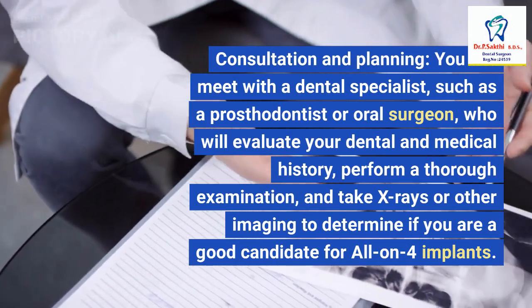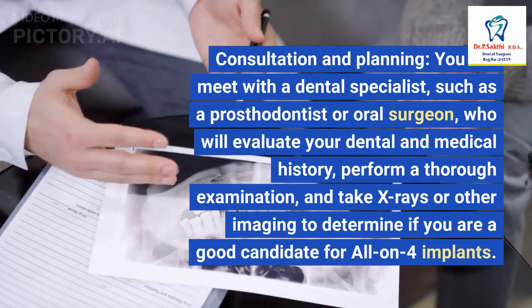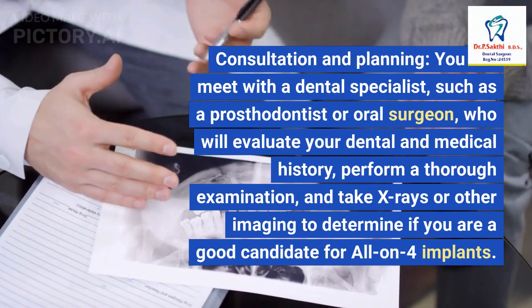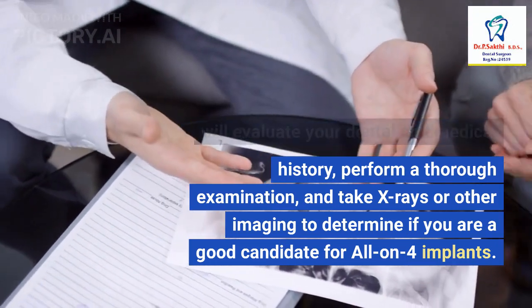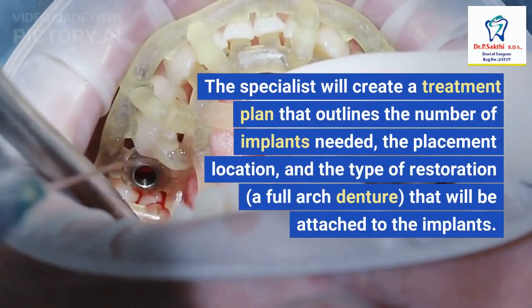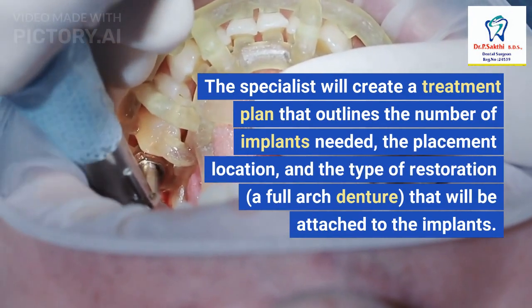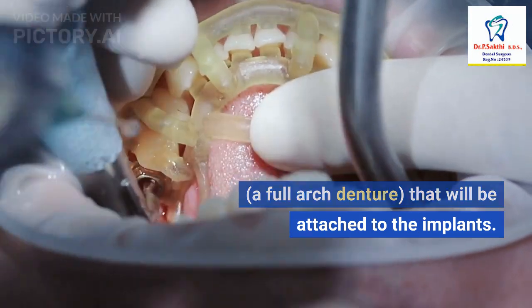1. Consultation and Planning: You will meet with a dental specialist, such as a prosthodontist or oral surgeon, who will evaluate your dental and medical history, perform a thorough examination, and take X-rays or other imaging to determine if you are a good candidate for All-On-4 implants. The specialist will create a treatment plan that outlines the number of implants needed, the placement location, and the type of restoration — a full arch denture — that will be attached to the implants.